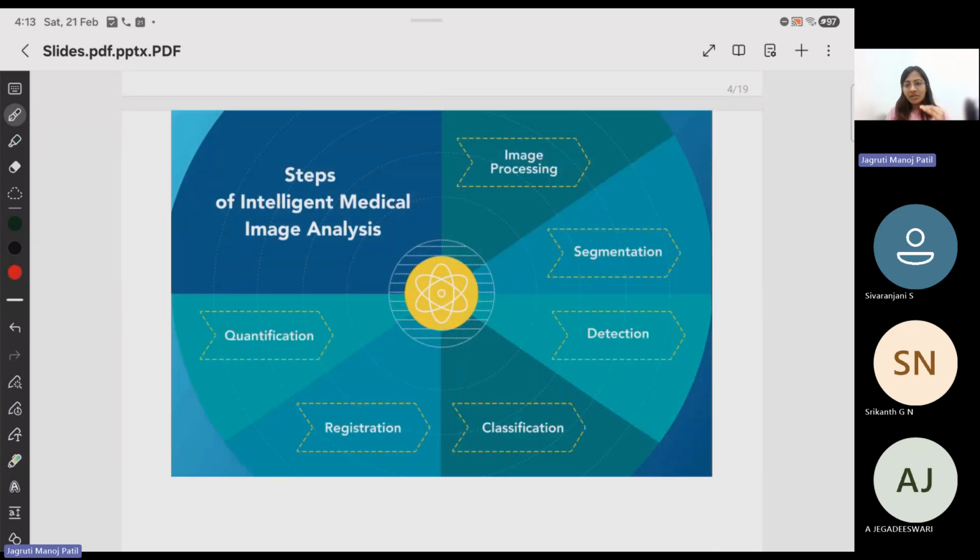Okay, so that was the conventional and traditional imaging modalities. Everything will give you data towards the end. And nowadays, the field is going towards data-driven analysis. How data-driven analysis works is you do some quantification, register, differentiate and classify, detect, and segment. For example, speckle is made up of multiple grainy textures that you see on an image due to constructive and destructive interference of the waves that you're getting.